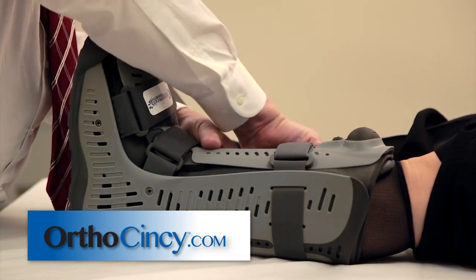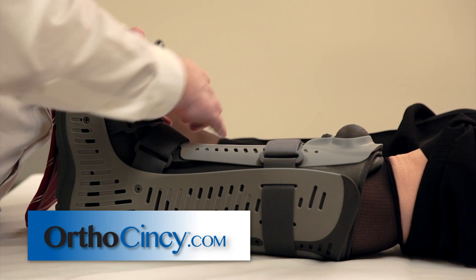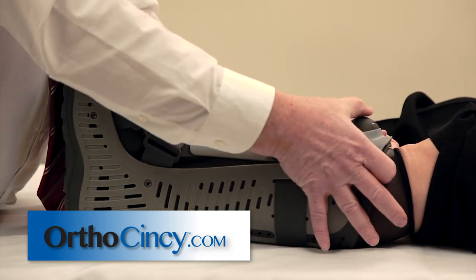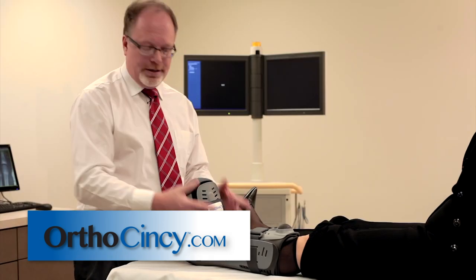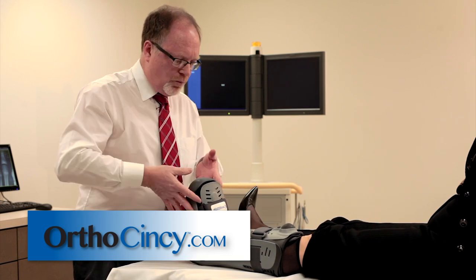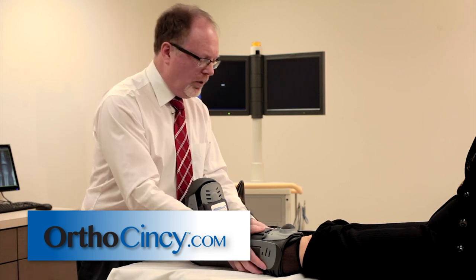Once we've done all three of those straps, we'll re-snug each one and then pump the boot up. The boot does not have to be so tight as to strangle the foot, but so tight so that the foot all moves as one. The foot and the leg all become just one structure — and that's what we really want to do.